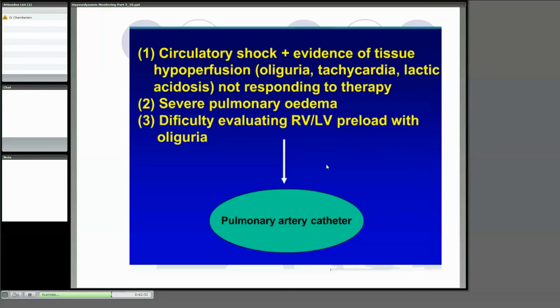The only thing with the pulmonary artery catheter is that your technique has to be spot on, because there are so many things you're measuring that if you do something imperfect in the data collection, your numbers for oxygen consumption and oxygen extraction go quite off the board. So you need to be well practiced with that.